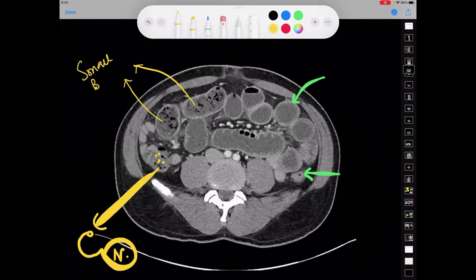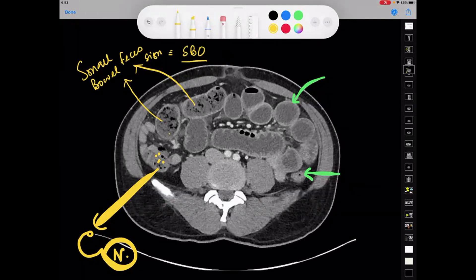This is called the small bowel feces sign, which equals a small bowel obstruction. Please understand this. I hope you have understood what the small bowel feces sign is.